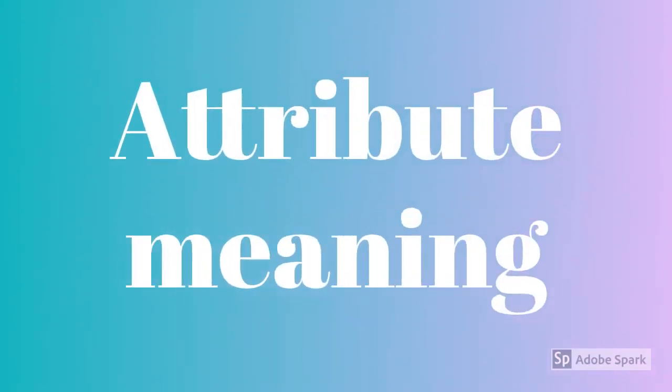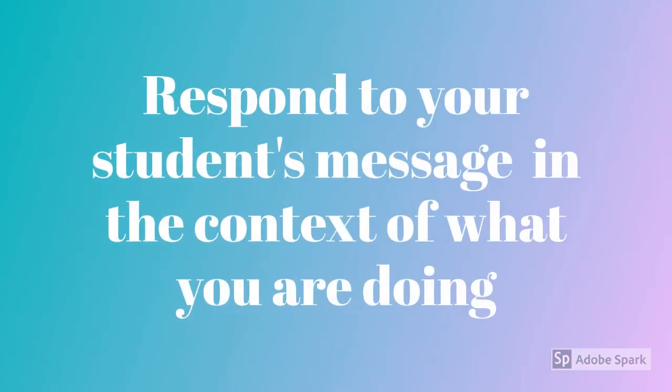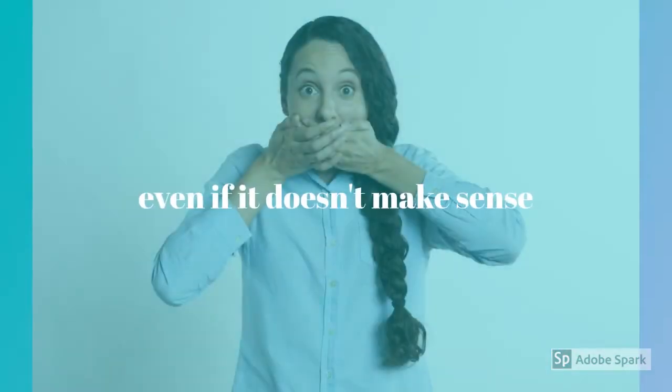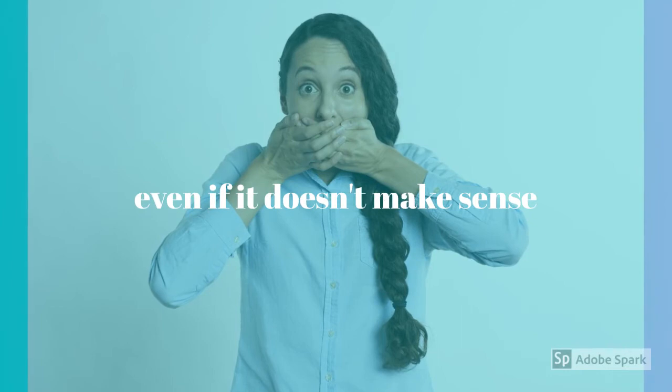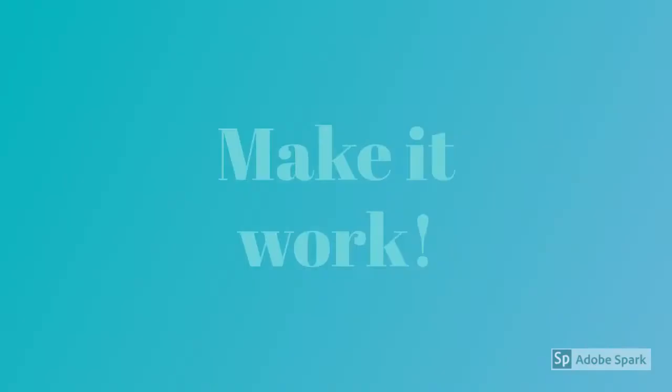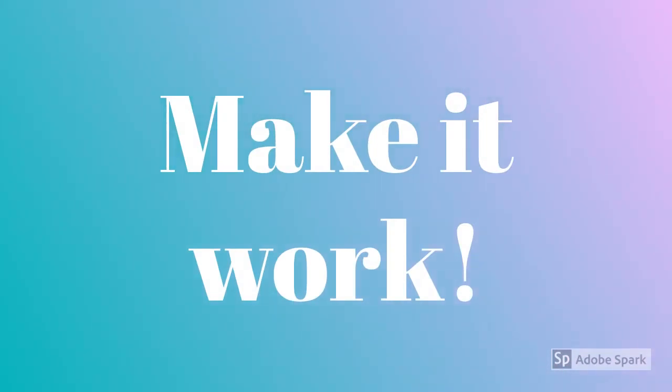Once your child begins to respond or communicates a message to you, you are going to attribute meaning. That just means you will respond to your student's message in the context of what you're doing. And don't ask them to imitate. Just let them say what they want, even if it doesn't make sense, or you know it is not what they wanted to say. Make it work as best you can.